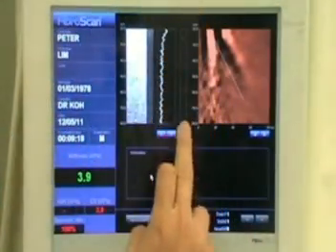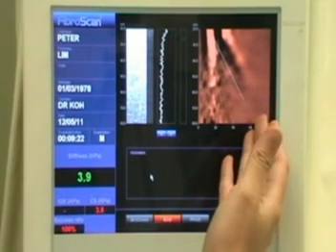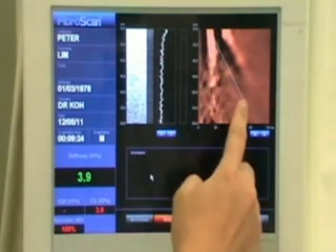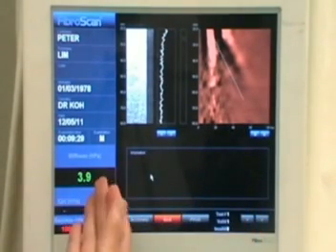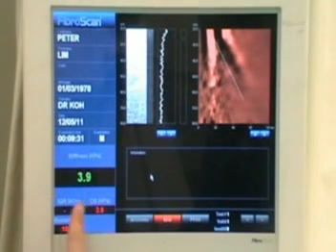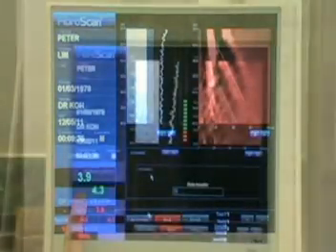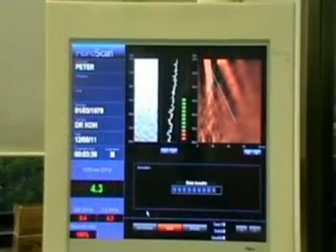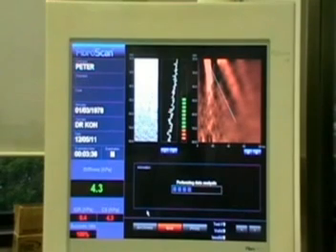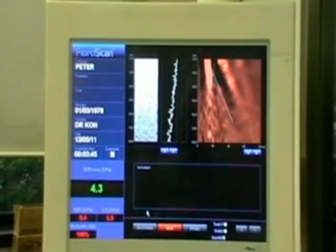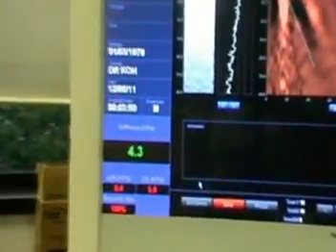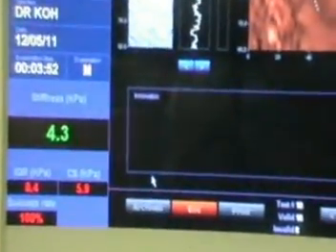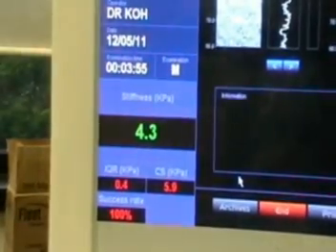Once the vibration or shear wave has travelled through the liver, a graph will be plotted showing the shear wave propagation through the liver. Stiffness will be calculated in kilopascals as shown in this column. If you are satisfied with the reading, continue to do another 9 readings to get a total of 10 readings at the same point. The median will be automatically calculated by the machine as the final stiffness result. The examination is then complete.